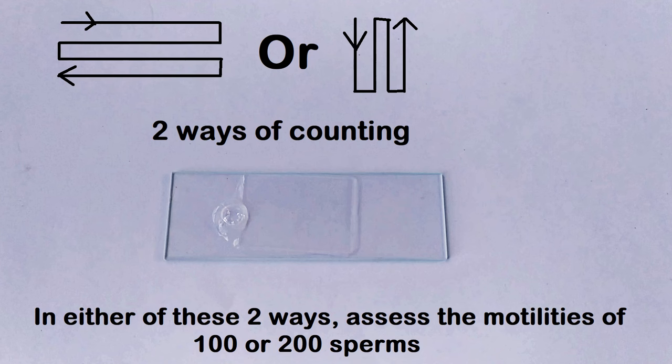100 or 200 random sperm cells are briefly observed one by one to check for motility or the lack thereof. To minimize the chances of repeated assessment of the same sperm cell, the microscopic field of view is changed frequently in a specific order of movement, such as from the left corner of the slide to the right corner, until 100 or 200 cells have been assessed.